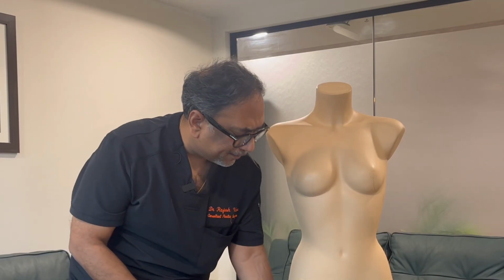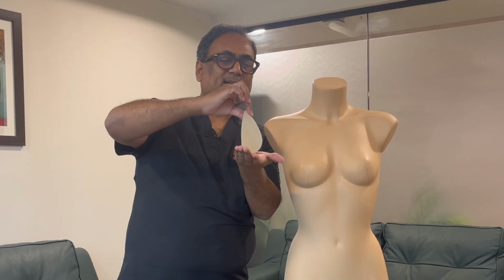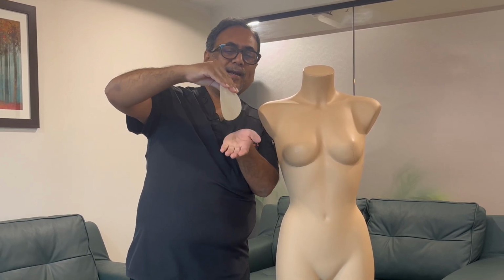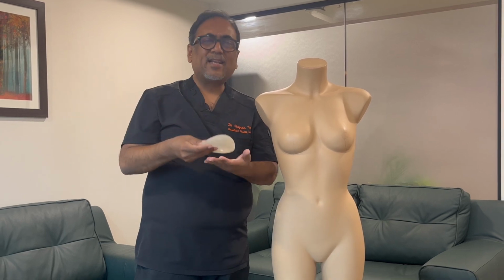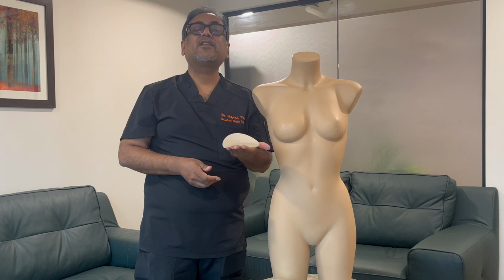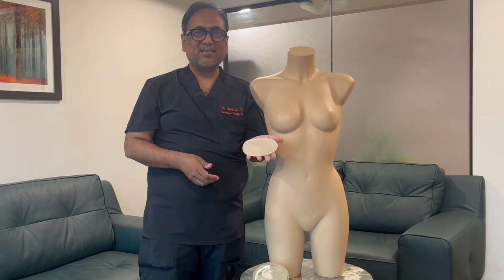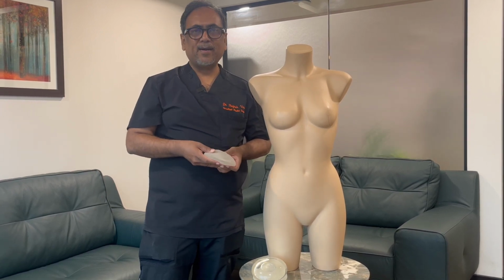Exceptionally, we might be using the anatomical implants. You can see that this has a teardrop shape. It's tapering towards the upper pole, and it is rounded in the lower pole. So in a few clinical conditions, or if the patient really prefers a very natural augmentation, we would be using an anatomical implant like this. But generally, by and large, the round implant is the most commonly preferred implant in our practice.